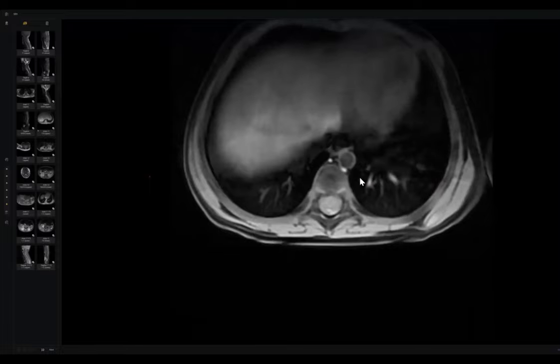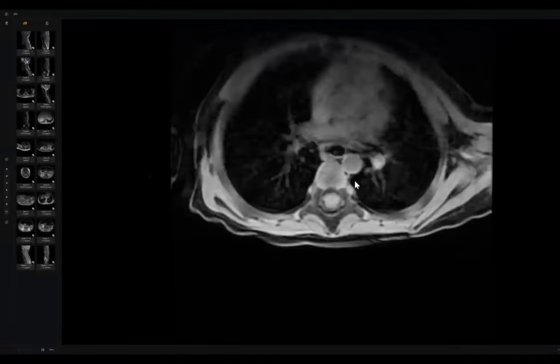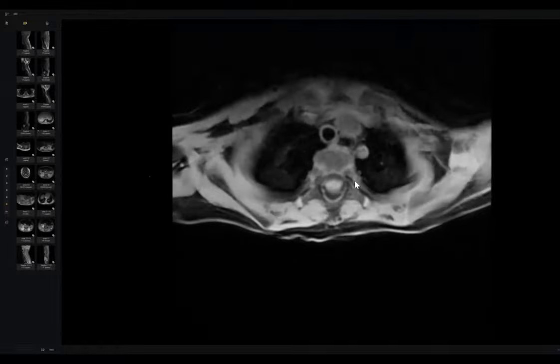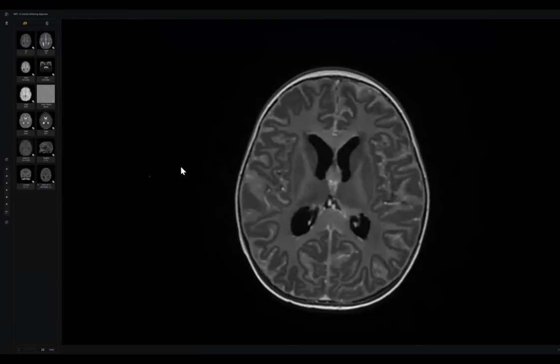If you find any pleural effusion here or any consolidation here, you should be in doubt about TB, tuberculosis. So she did very well when she asked me. I'm talking about candidate one about the brain MRI.